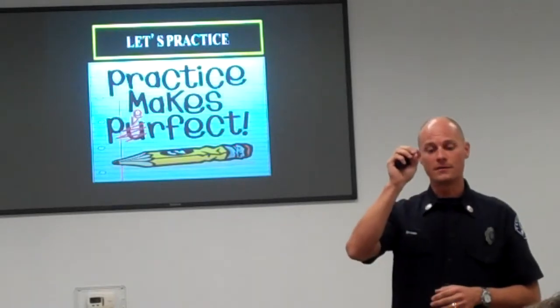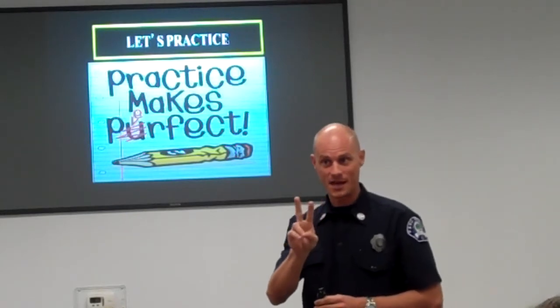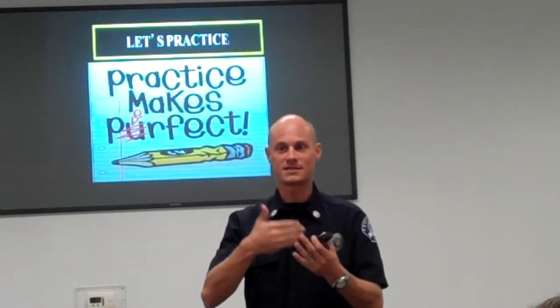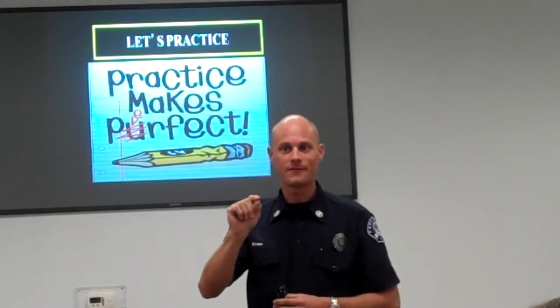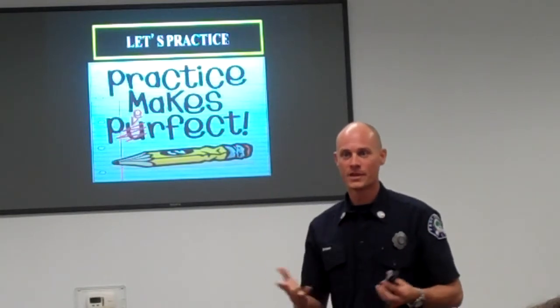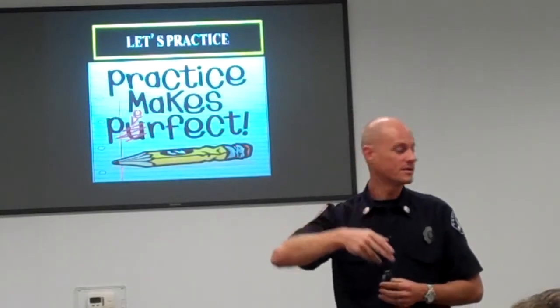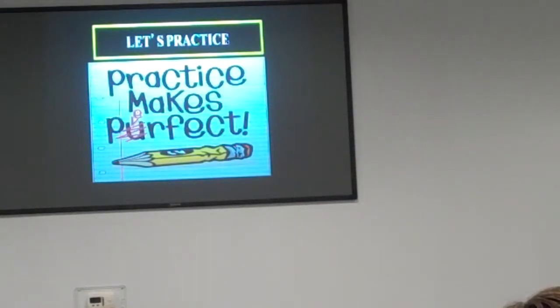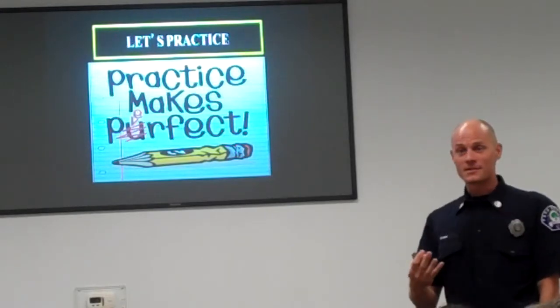Then I go to leads V1, 2, 3, and 4. That's my second step, where I look at the septal anterior portion of the heart. Third and last step is I look at V5, V6, lead 1, and AVL. So first step, inferior; second step, septal anterior; third step, the V leads, the lateral sides. Does that make sense? Three steps, you should be able to identify any STEMI. Real easy. Let's give it a try.